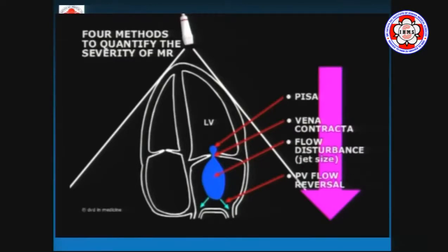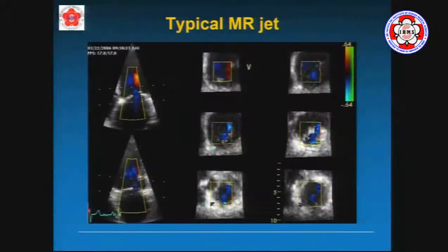I come from Bangalore, so if you imagine this in Bangalore terms, this would be like Bangalore roads. This would be all the traffic trying to get into this narrow orifice, and then finally we get out and then we go this way, that way. So that's what mitral regurgitation is like. So when we quantify mitral regurgitation, all of these 3 things can be used to give you the grading. Is it 1+, 2+, or if you want mild, moderate, or severe, and so forth.